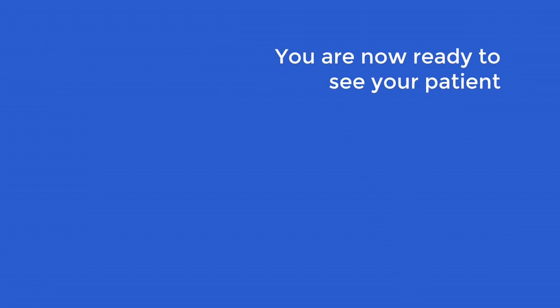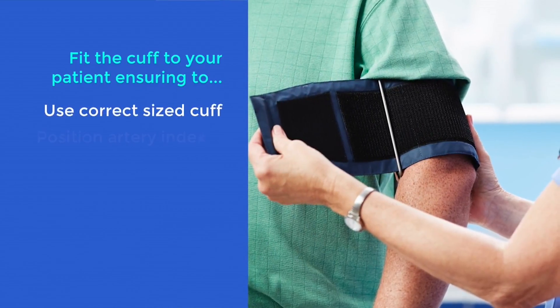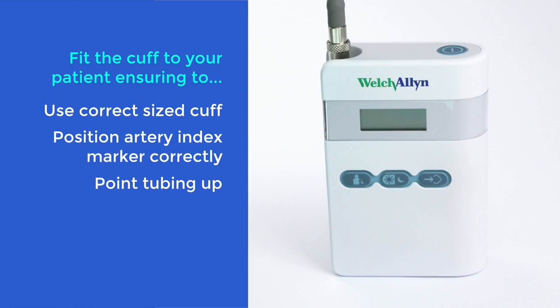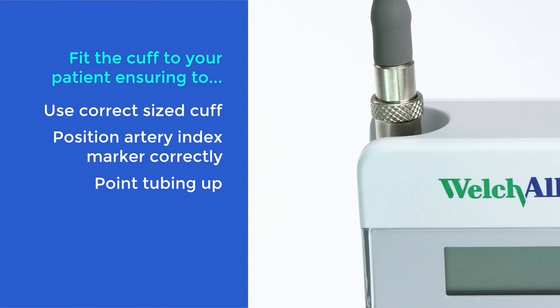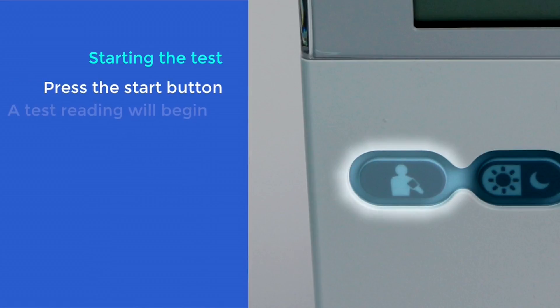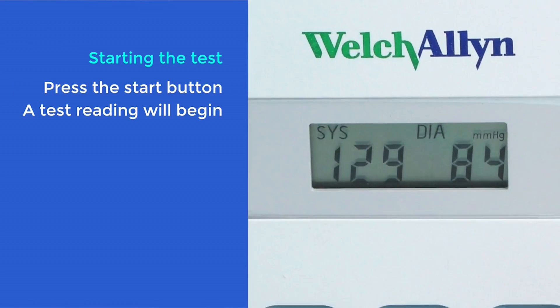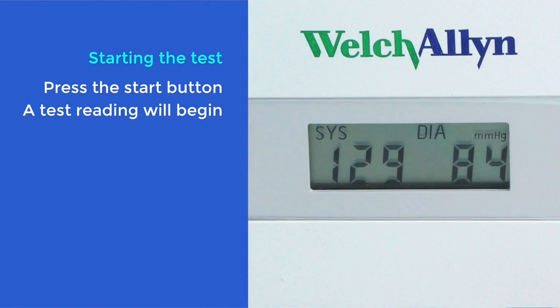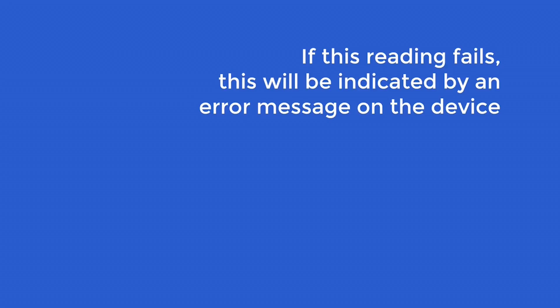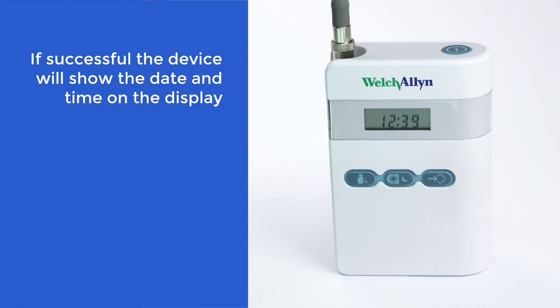You are now ready to see your patient. When you are ready, fit the correct size cuff to your patient with the cuff tubing pointing towards the top. Attach the cuff tubing to the ABPM. To start the test, press the start button on the front of the unit. The device takes a test reading which you will be able to see on the display. It is important that this reading is successful, otherwise no further readings will be taken. If this reading fails, this will be indicated by an error message on the device. If successful, the device will show the date and time on the display.